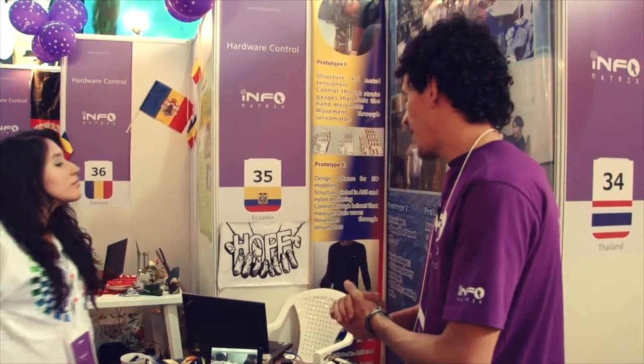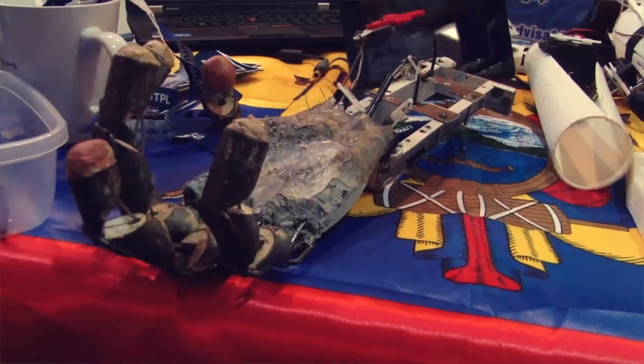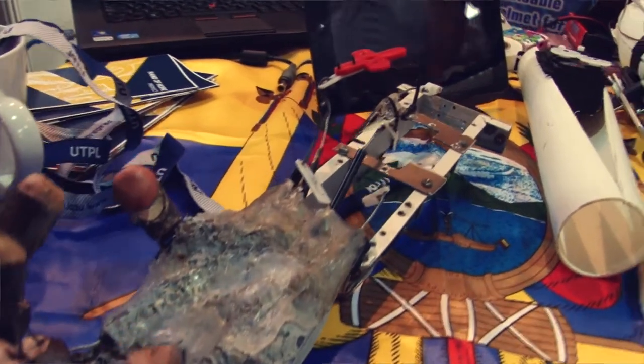My name is Cristian Ramirez. My name is Veronica. Our project is a low-cost prosthetic, and here's the person wearing the hand.